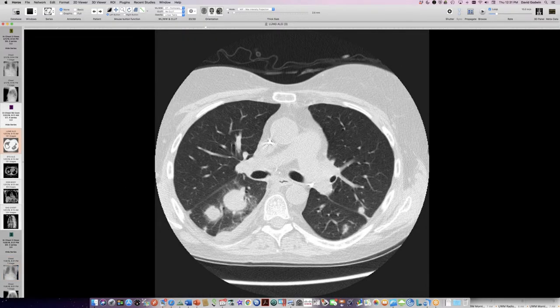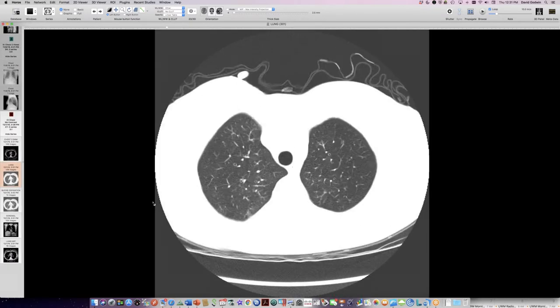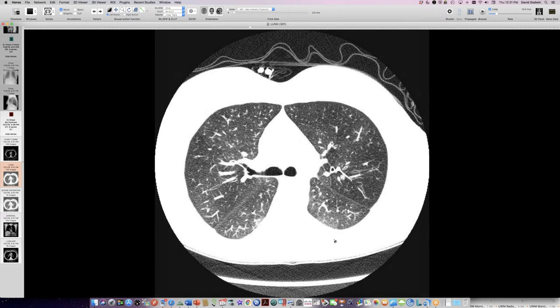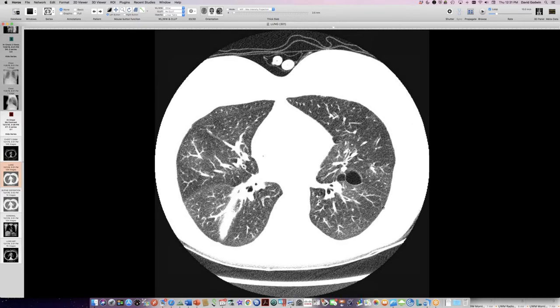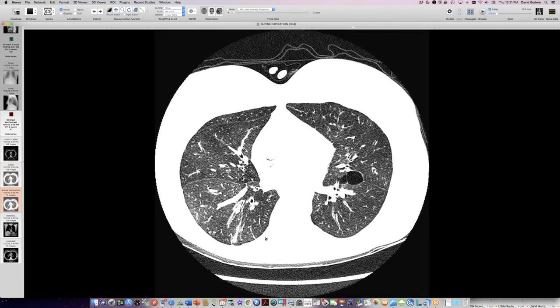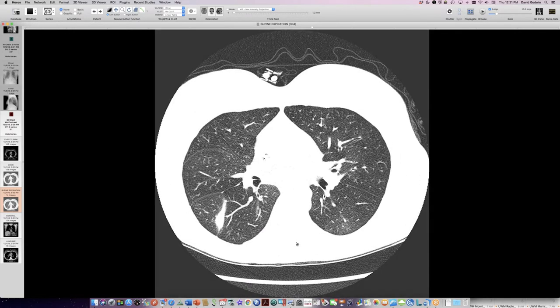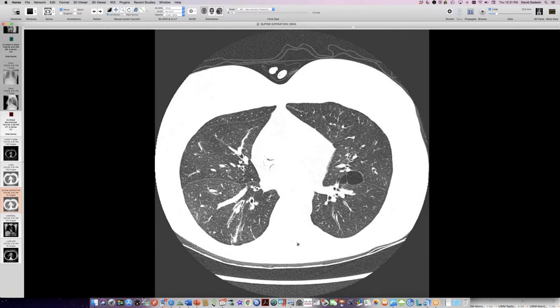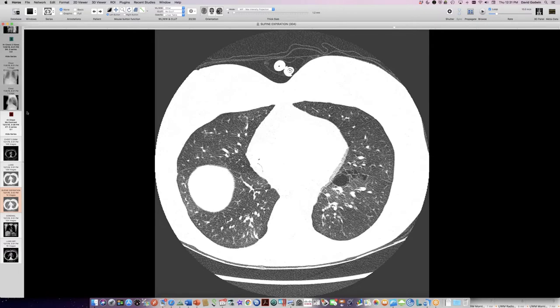around that time. Whoops, that's not the CT I wanted to show right away. Let me show you this CT. This CT shows some mosaic attenuation, not as dramatic as Howard's case, but still a substantial amount of air trapping. And I've got expiration to show you that there is air trapping with this. So she had constrictive bronchiolitis as a result of her stem cell transplant. She had airflow obstruction and she got a lung transplant.